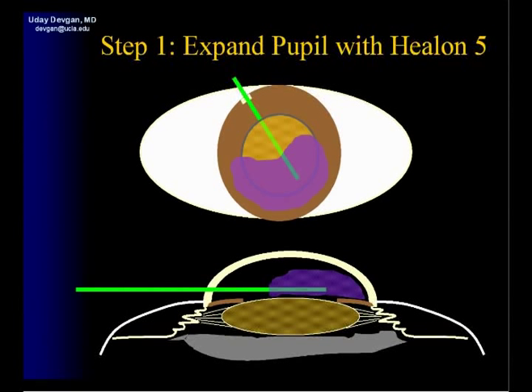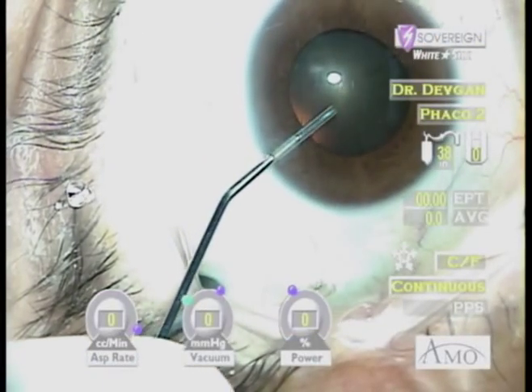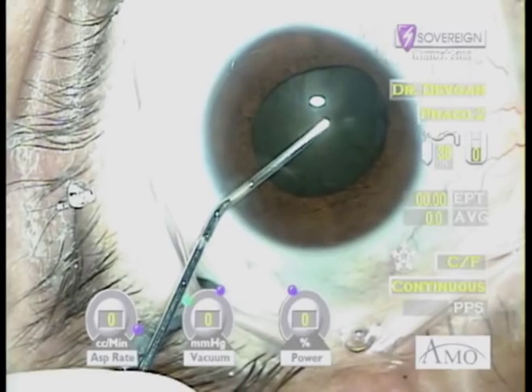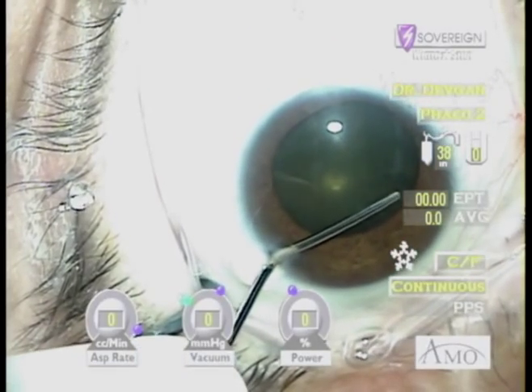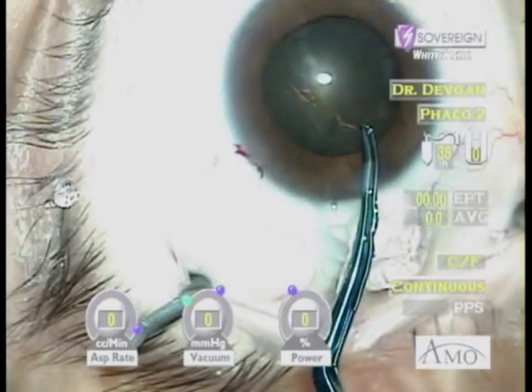We'll first use the Helon 5 to expand the pupil. This technique of viscomydriasis, as first shown to me by Dr. Bobby Osher, is very useful. We'll inject the Helon 5 at the plane of the iris and pupillary margin, and we'll see that we're able to more largely expand the pupil and at the same time flatten the anterior lens capsule. This makes creation of the capsulorhexis very simple.